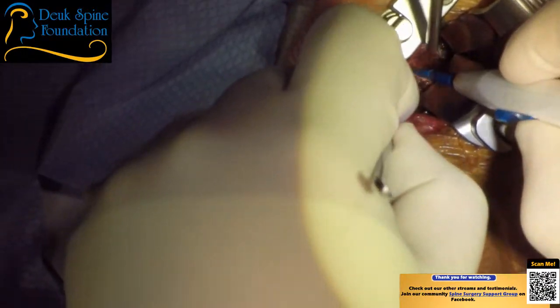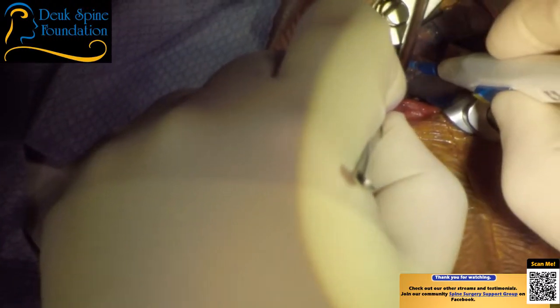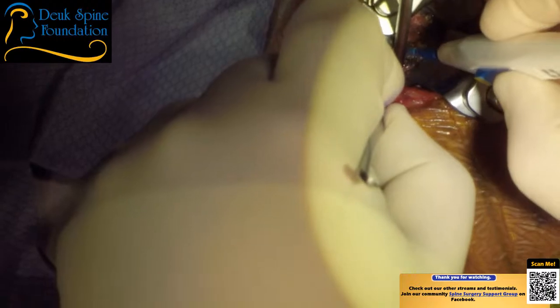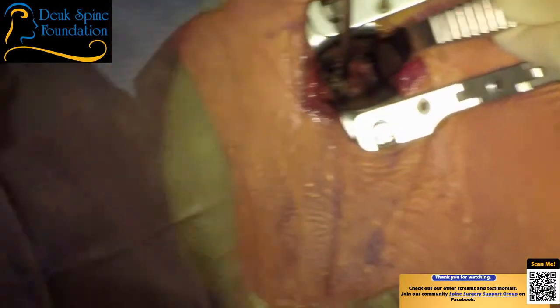And again, it's very hard to do because he's got such a thick neck. But I need to be right on the bone. I don't want to go through soft tissue. Okay, so that's where my post is going to go, right in the middle.